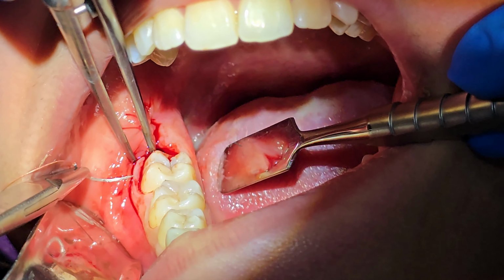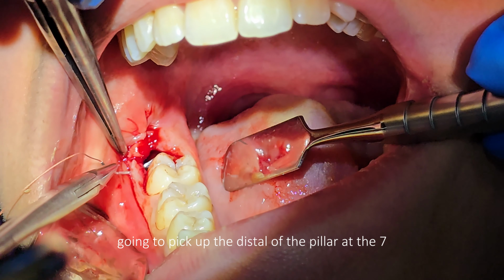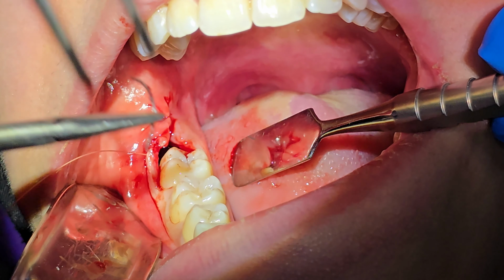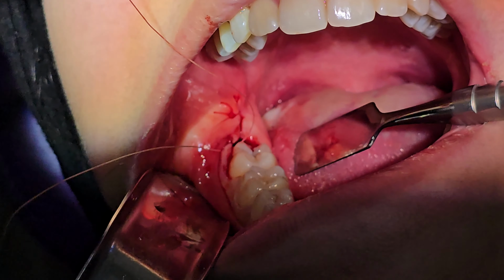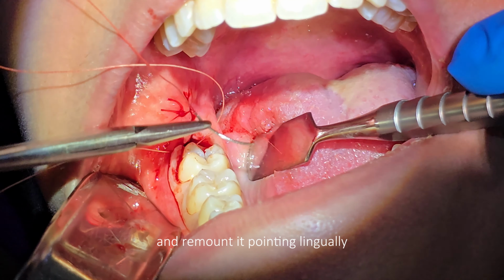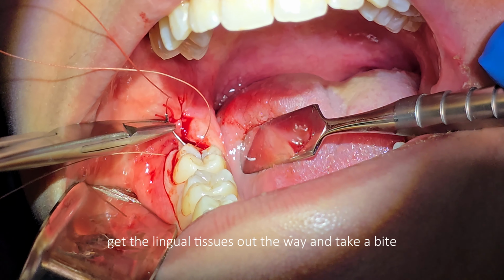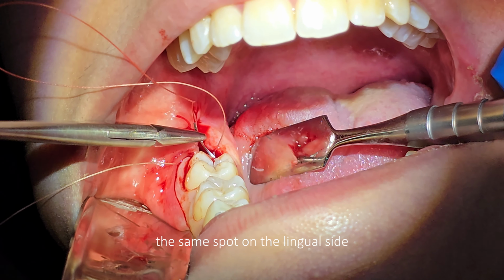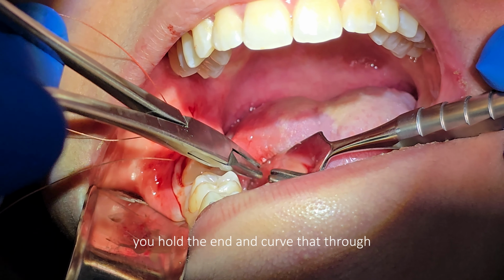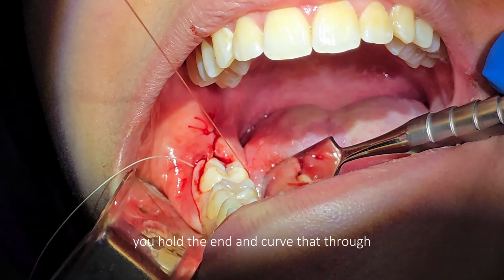Second suture, I'm going to pick up the distal papilla of the 7, curve it through. And then remount it, pointing lingually, get the lingual tissues out of the way, and take a bite at the same spot on the lingual side. Get hold of the end, and curve that through.